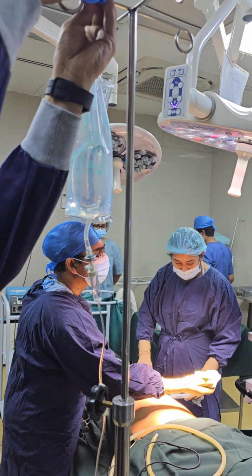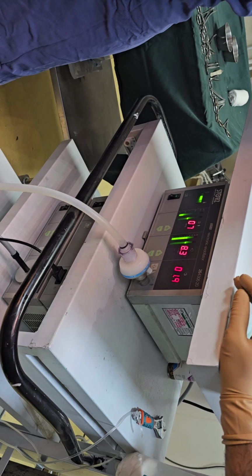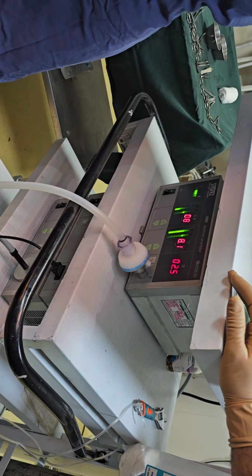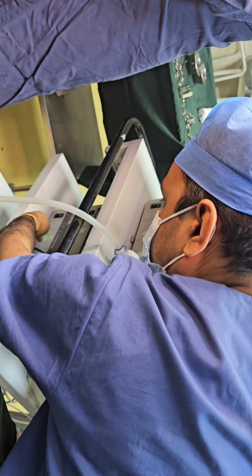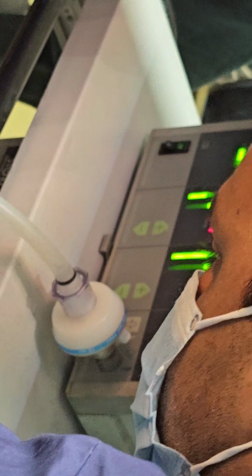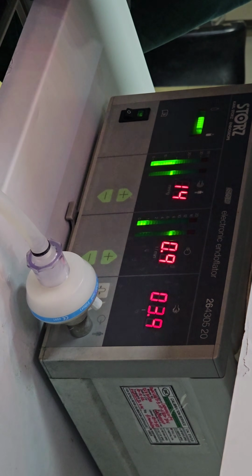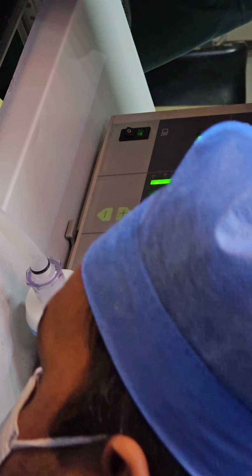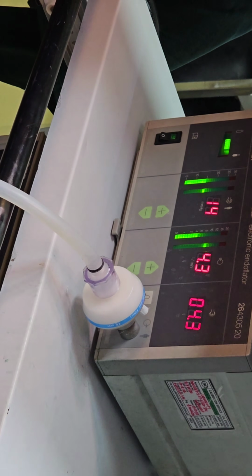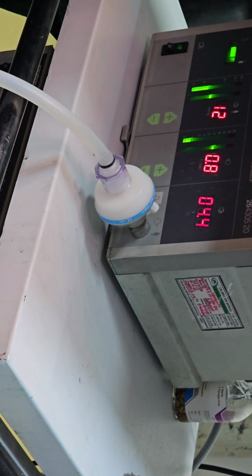It is for post-operative pain killing. As we know, it needs some time to activate in the body. Now we are seeing the gas machine, which provides the insufflation gas intra-abdominally, which will establish the pneumoperitoneum. Now we are seeing the intra-abdominal pressure fluctuating from 12 to 14 and 15 millimeters of mercury, and we expect to have this type of intra-abdominal pressure throughout the operation.